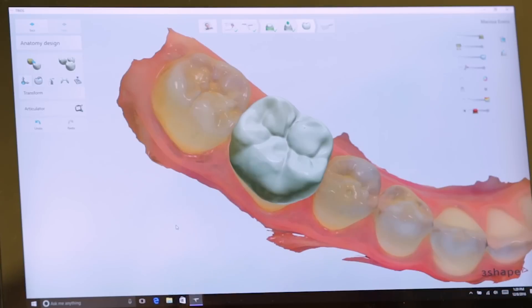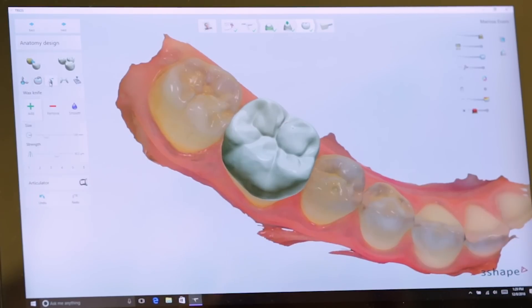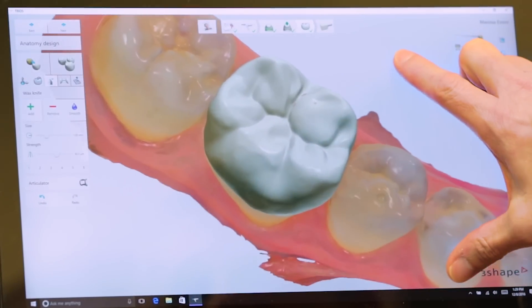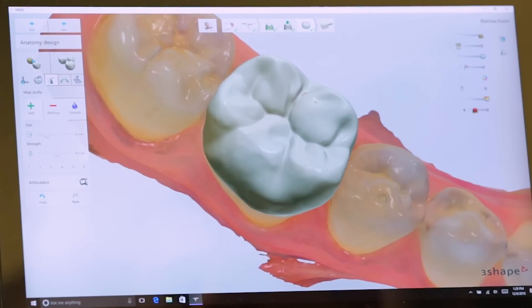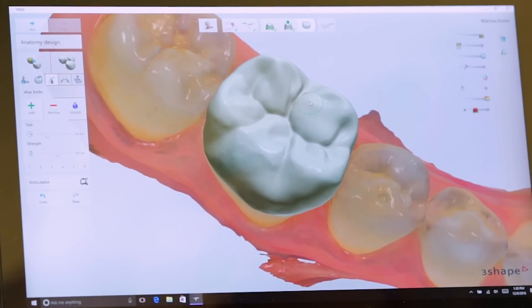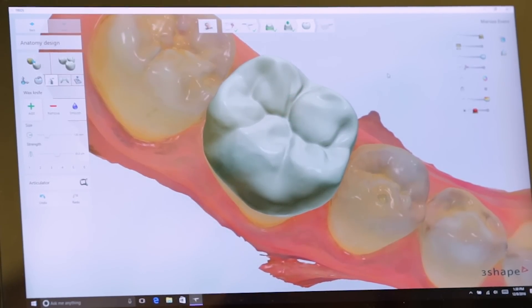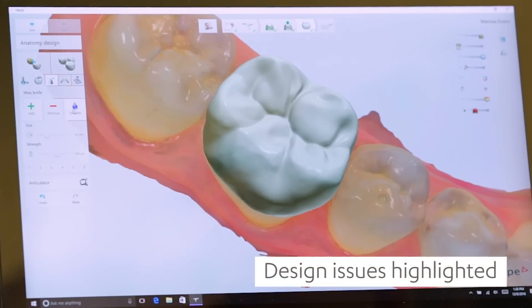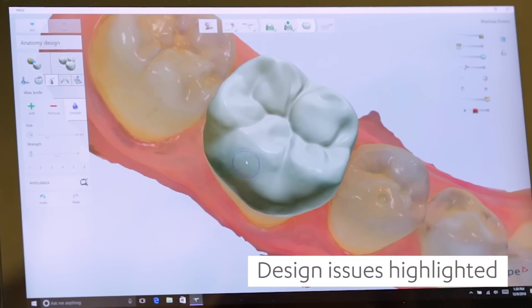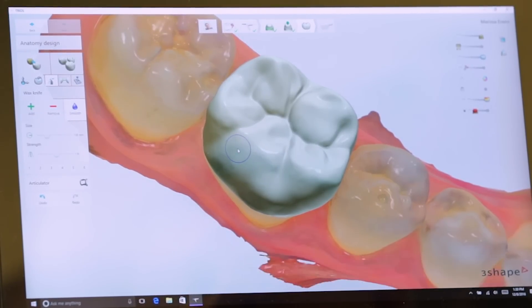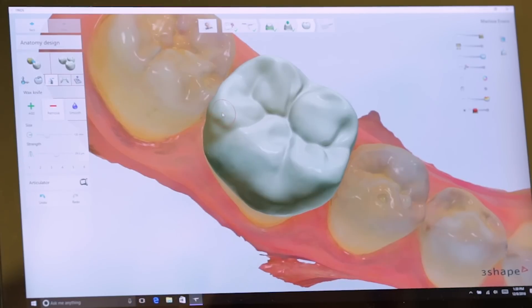Once you confirm the design you want, you can add to or take away from the restoration. The areas that are slightly pink, I can go in and easily add to and paint over. Now those areas are at a nice thickness. We can also smooth areas — if you want less anatomy, you can smooth those areas. You can also remove areas if you think you have too much bulk; it's very easy to remove in the software.